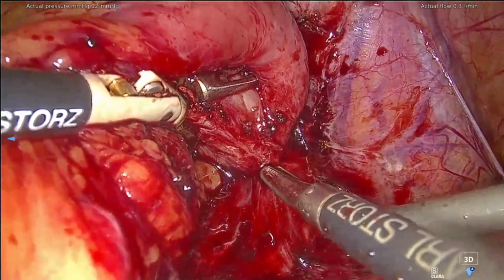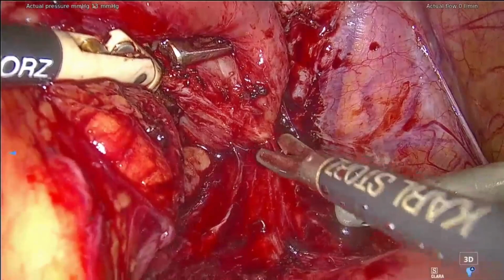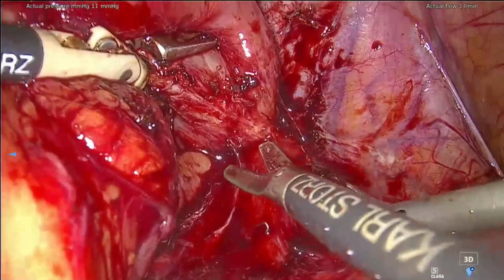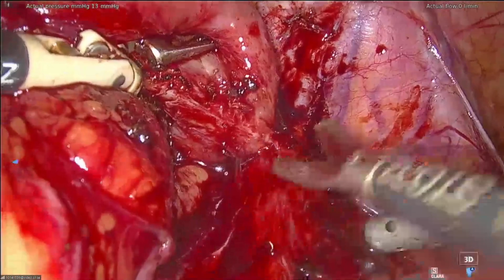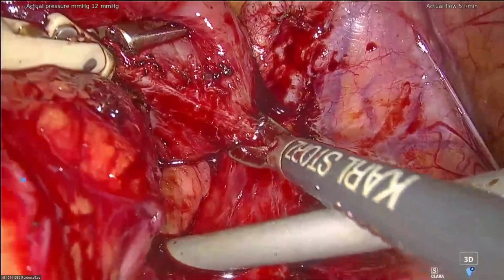The idea is just to release this loop carefully. Like that, we will have a better view on the distal part. But all the tissue here is really fibrotic, and I suspect that this is the reason why we have the stenosis. Also, strategically, my ports are placed in another manner due to the Bricker, and I put more ports on one side. It seems to come well. It's not too bad for the moment. I'm careful because the iliac is just there.